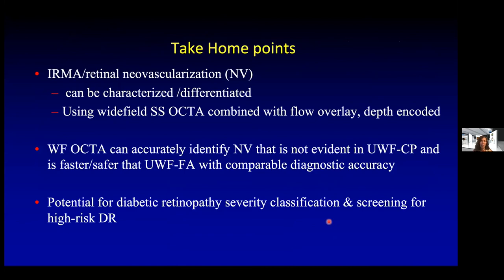I'd like to start with the take-home points for my talk on proliferative diabetic retinopathy. First, IRMA and retinal neovascularization can be characterized and differentiated using wide-field swept source OCTA combined with flow overlay. Second, wide-field OCTA can accurately identify neovascularization that may not be evident on ultra-wide-field color fundus photography, and it's safer and faster than ultra-wide-field fluorescein angiography with comparable diagnostic accuracy. Third, this has great potential for diabetic retinopathy screening and perhaps even a new classification system to better evaluate and treat eyes with high-risk diabetic retinopathy.